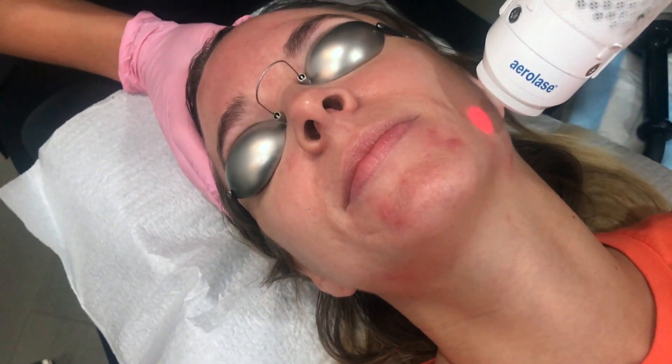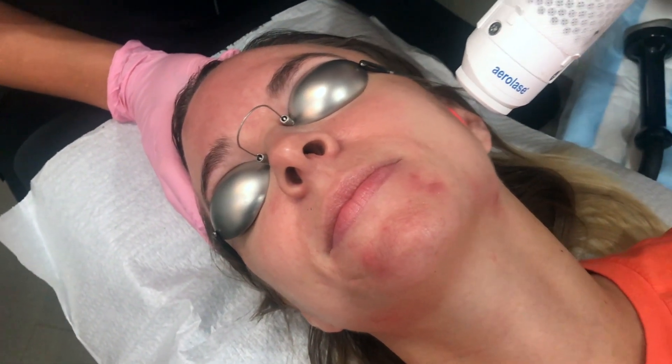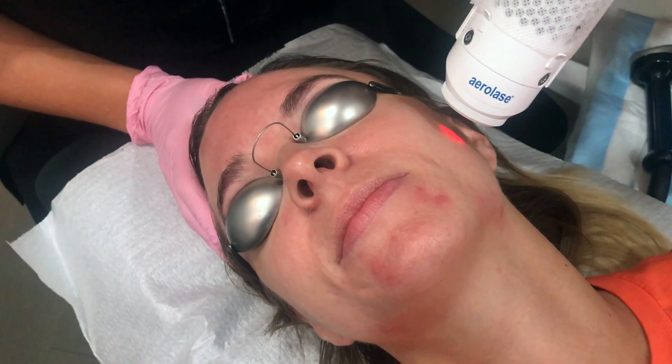What this will do is improve the redness, it will kill the bacteria associated with acne, and it will shrink the sebaceous glands.